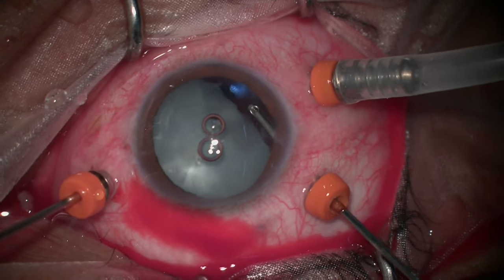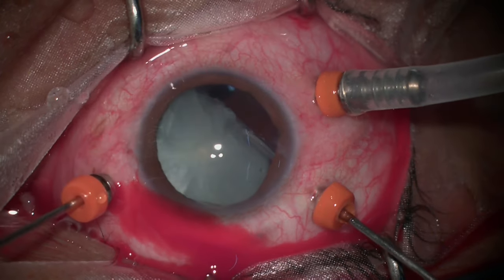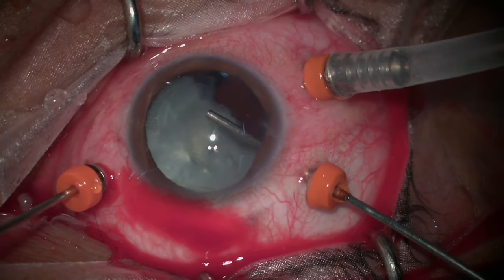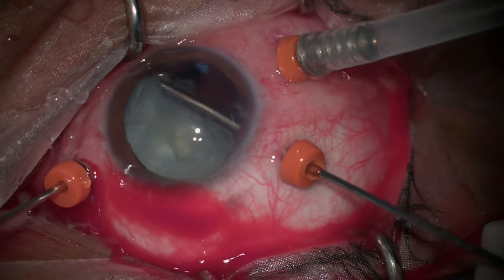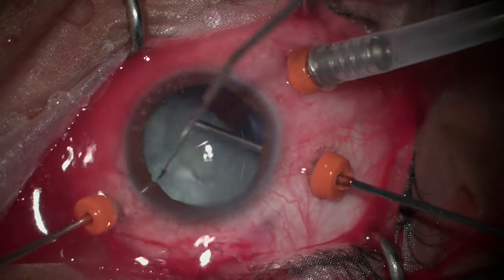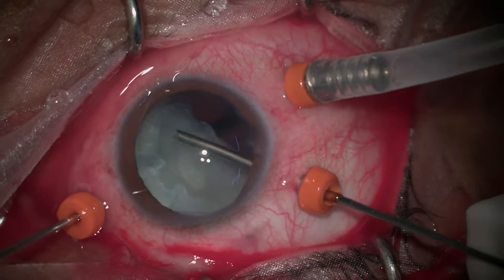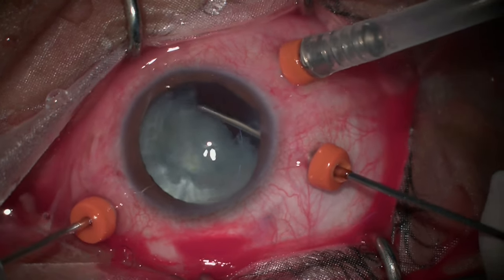This being a soft cataract, after the incision at the limbus has been placed, we place the trocar cannula for the infusion and the trocar cannula for the light pipe and the cutter, and we start consuming this lens using the vitrectomy cutter.